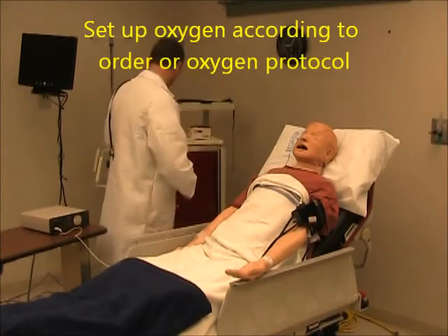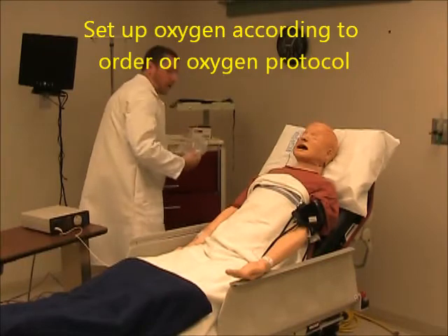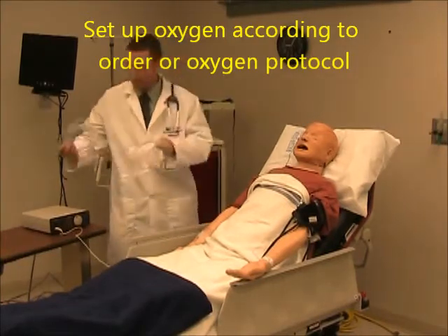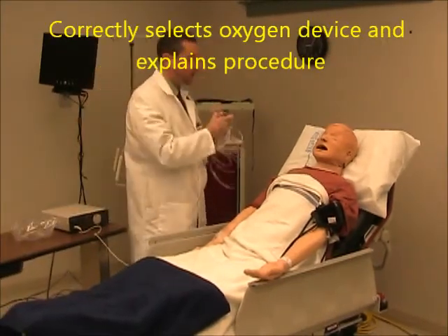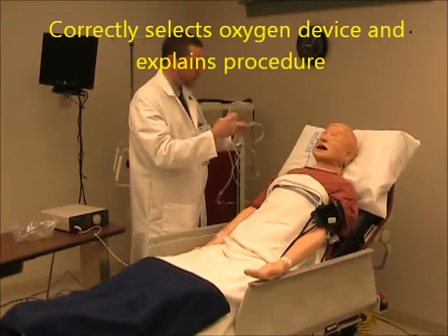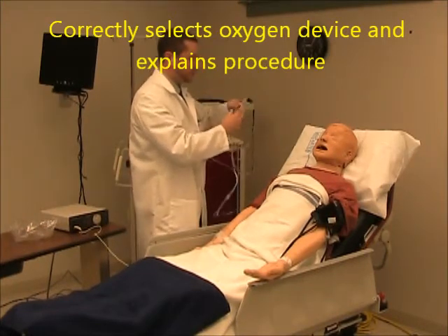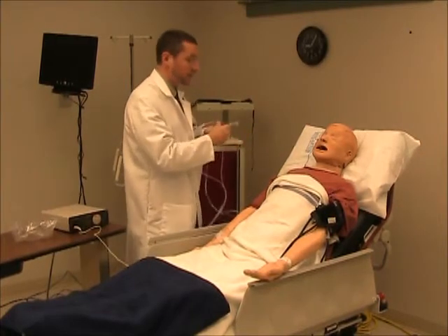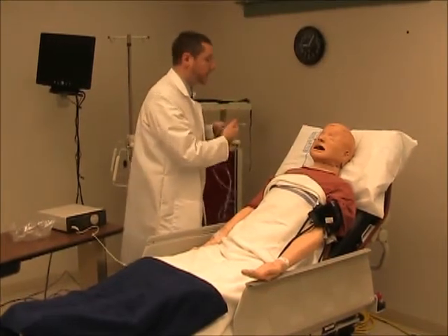We're going to set you up with a nasal cannula here this morning. It's just going to be a little bit of Oxygen that's going to go in your nose, around your ears, and we'll tighten it up just under your chin. It'll give you just a little bit of low-flow Oxygen to increase your Oxygen level. We'll continuously monitor your Oxygen to make sure that it's enough for you.